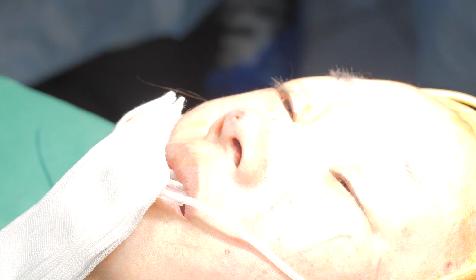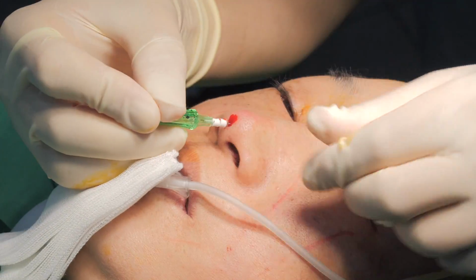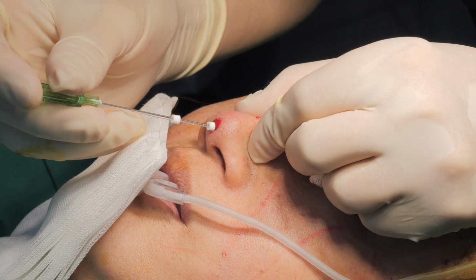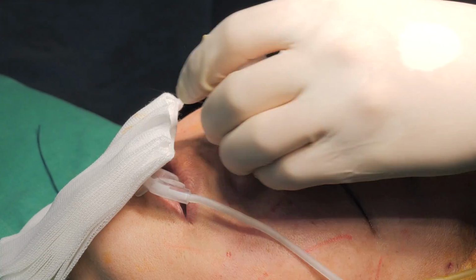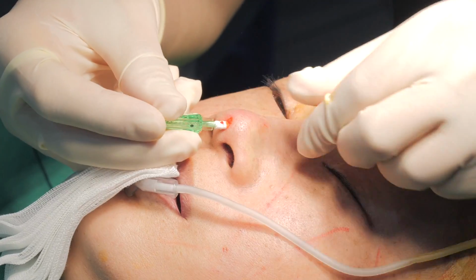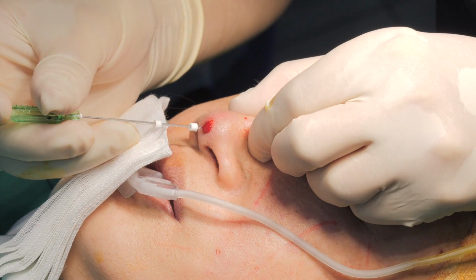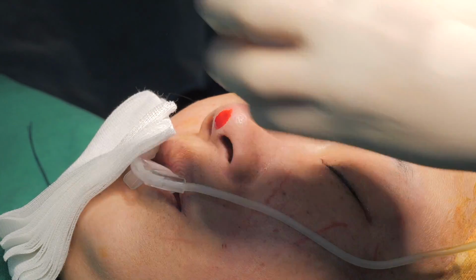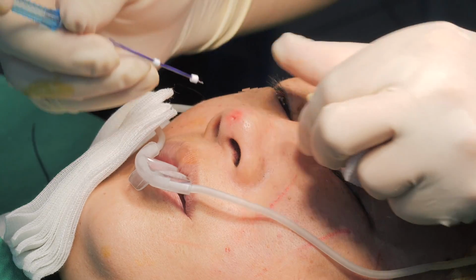Next, Bisu 2, Bisu 1 for the nasal tip elongation. For the beginner, do not insert too many Bisu 2. It can make asymmetry. 2 is enough. Sometimes 1 is enough. Bisu 1 to elongate the nasal tip.